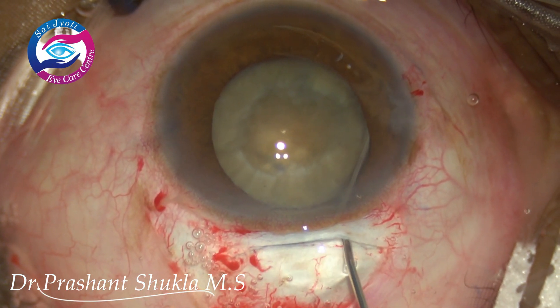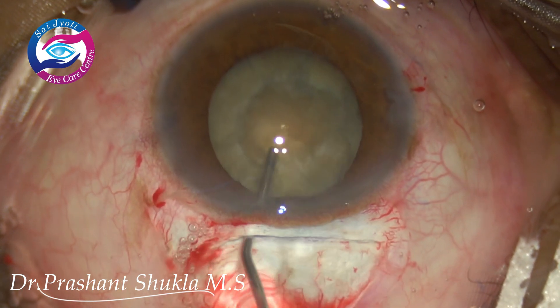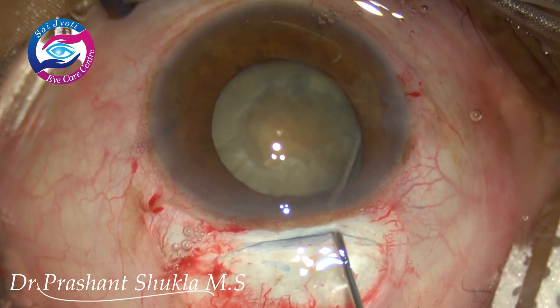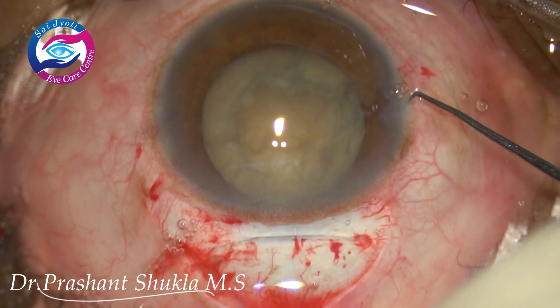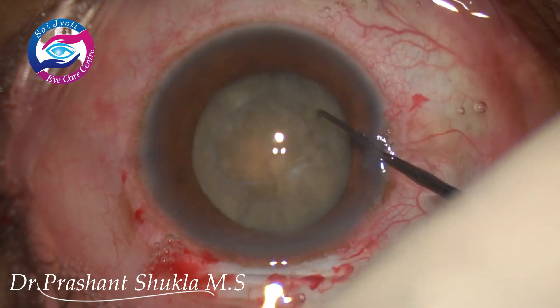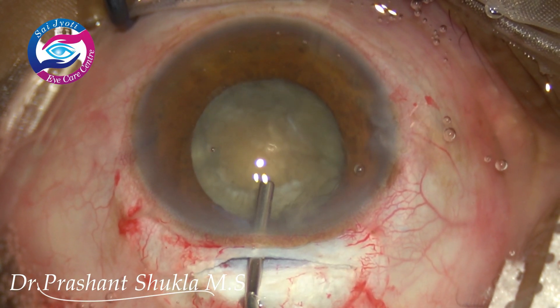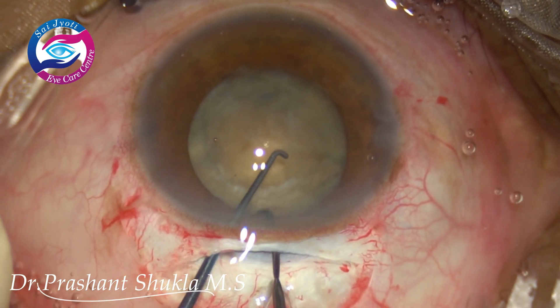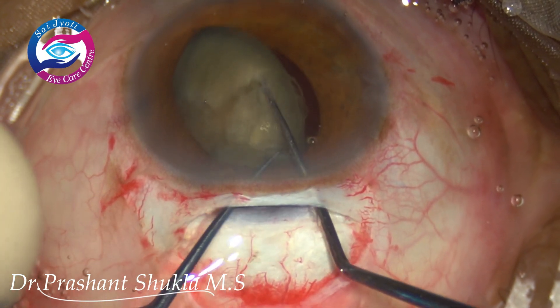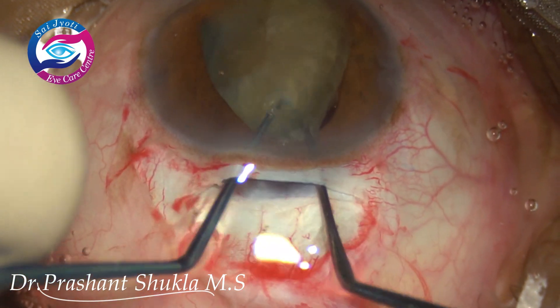Gradual hydrodissection is being done. The nucleus is slightly tapped just to release all the trapped fluid behind it. Now I am rotating the nucleus after putting some viscoelastic. As soon as the viscoelastic is removed from the eye the pupil comes down, so after putting viscoelastic again, I am using two scleral depressors just to wheel the large nucleus out of the capsular bag through the small pupil.